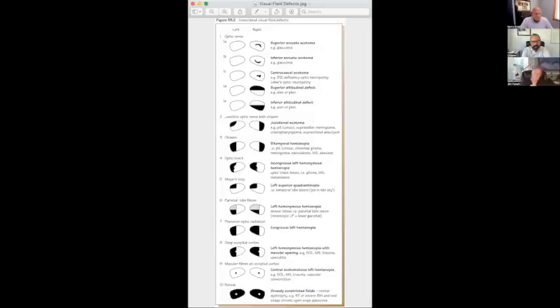I guess the only advice I would tell is that we need to be very careful, especially with an OCT, and not necessarily the same applies for visual field. But when you look into an OCT and you're seeing an RNFL defect, we should not think about glaucoma always.